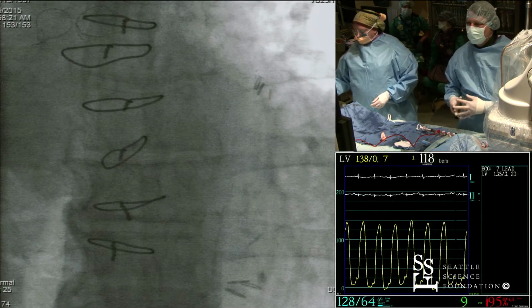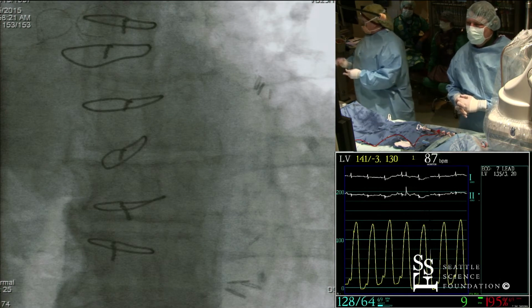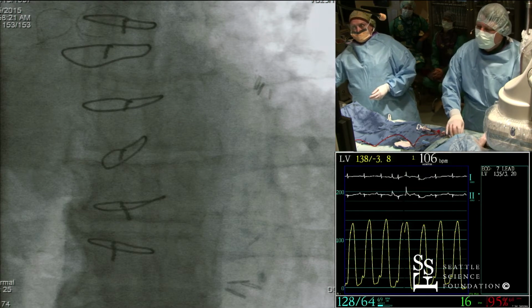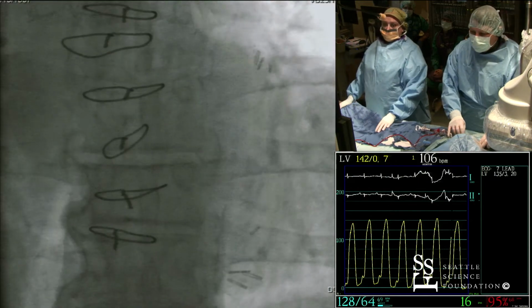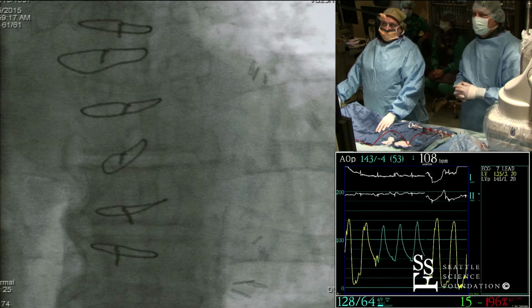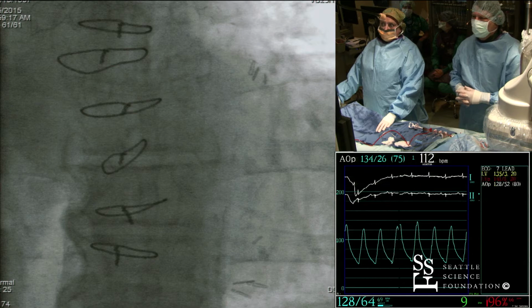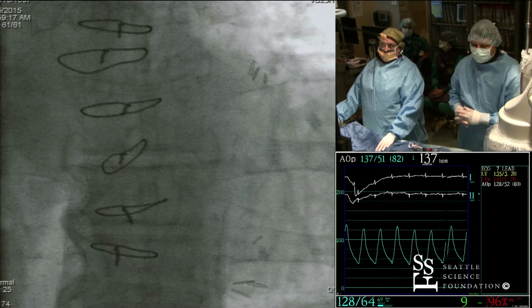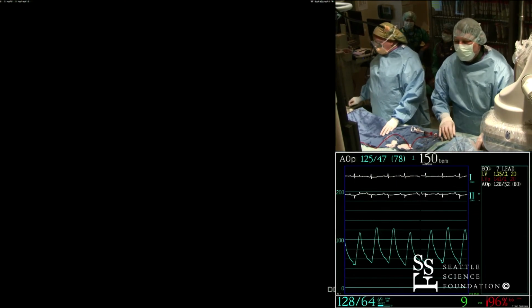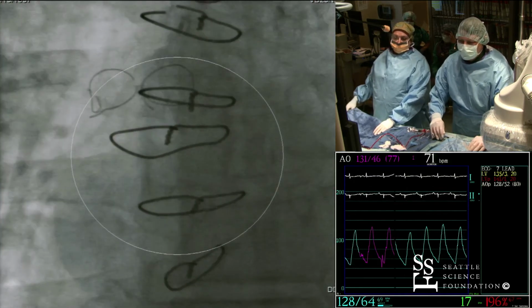One catheter that's worked very well for us is the AR1. Actually, that was a discovery of one of our fellows. We were pulling our hair out trying to cross the valve, and he brought an AR1. When I walked out the catheter, and by the time I came back in, he was in. So we adopted that, and also for transaortic cases, which have a similar approach, we use the AR1 to cross the valve. It's worth trying. It has a little shorter arm than the AL1. The AR1 allows you to center much better in the root of the aorta in order to direct the wire and cross.